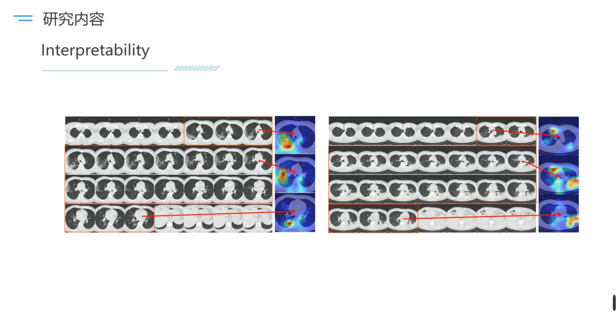From the figure, we can see that the proposed model has paid more attention to the lesion regions, which can clearly reflect the location information of the lesions. The visualization results are consistent with the clinical diagnosis basis, which further verifies the reliability of our method.